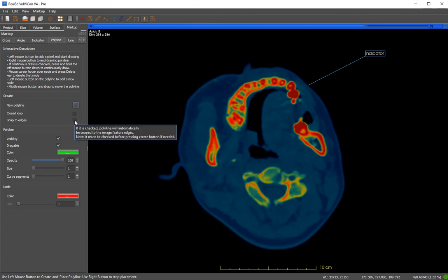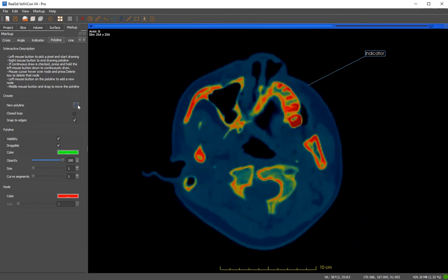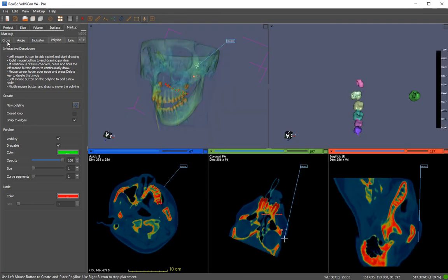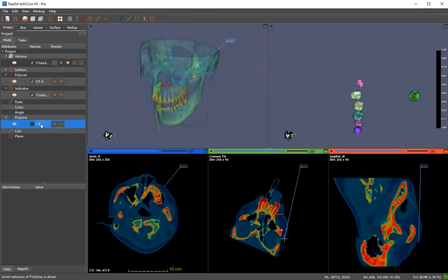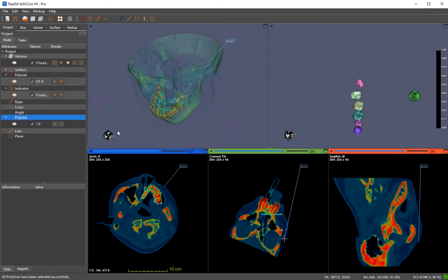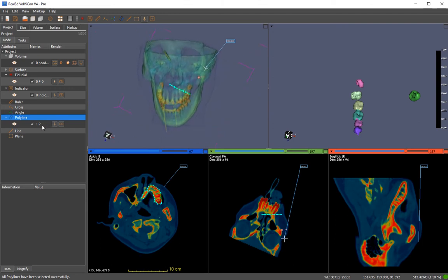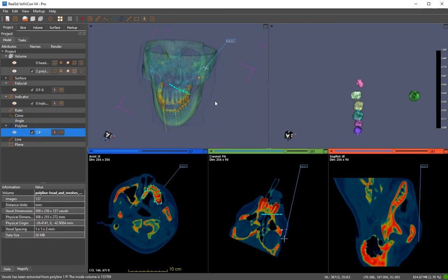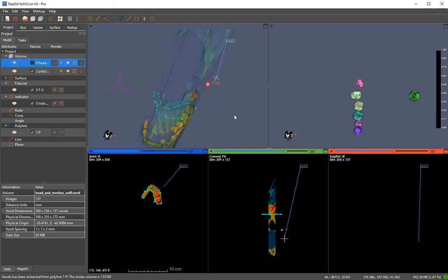I'm going to click 'Snap to edges' and press 'New polyline'. If you go to the polyline you can see the drawn area. Since we drew in the axial view, we can extract this area from the axial view, and you can see we have extracted that area.